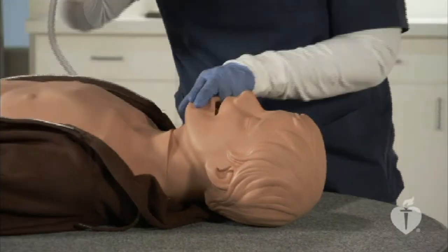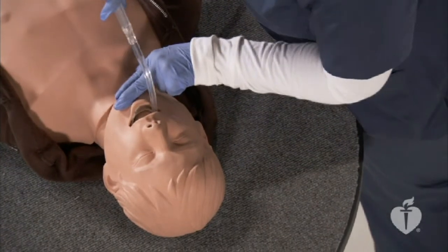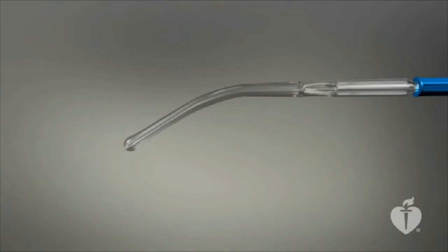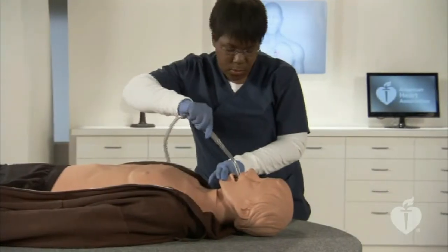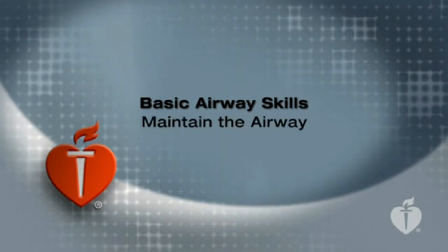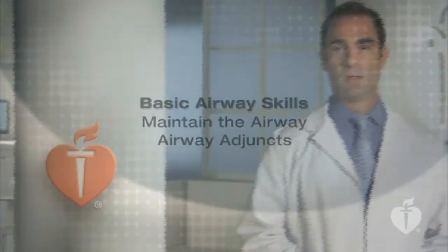The second step is to clear the airway. Here, suctioning may be necessary to remove secretions or foreign material from the mouth and base of the tongue. Use a large bore, non-kinking suction tube and a large suction catheter with a semi-rigid pharyngeal tip. High suction pressure may be required. Once the airway is open and clear, you may consider an airway adjunct to maintain patency.